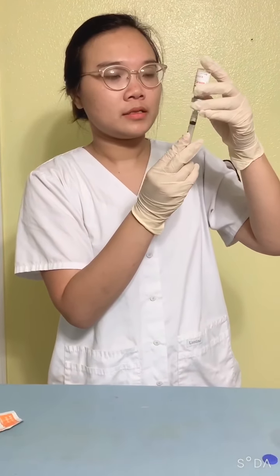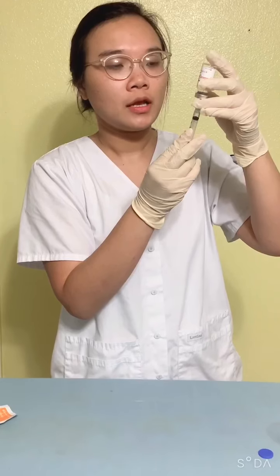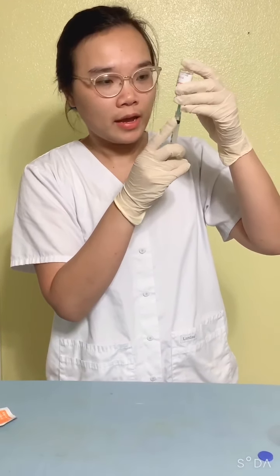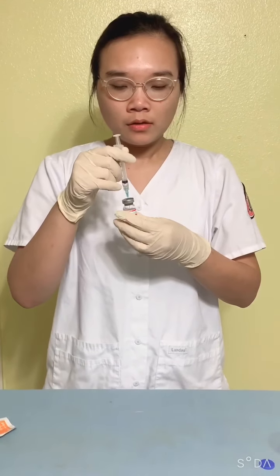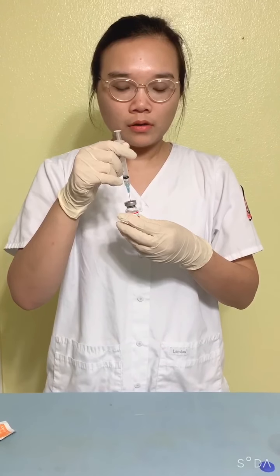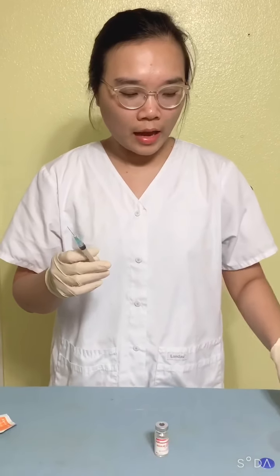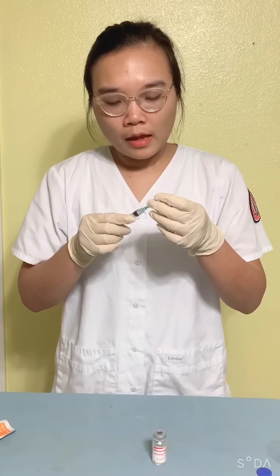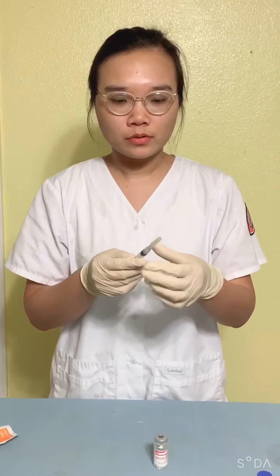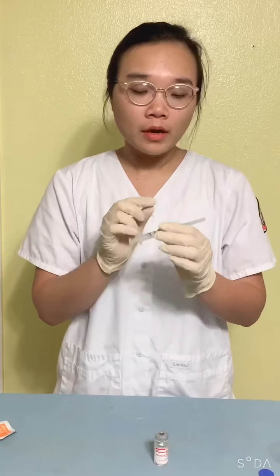Trying to maintain the sterility of the medication and making sure there's no air bubbles. Now I'm going to withdraw the medication out of the needle, and then I will safely cap it and appropriately change needles. And then I would label the syringe if withdrawn outside of patient's room.